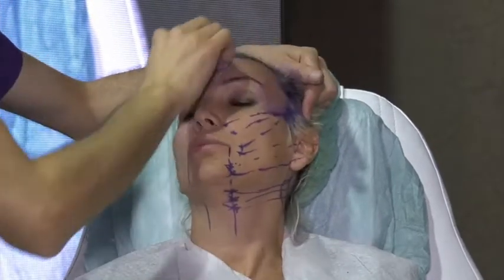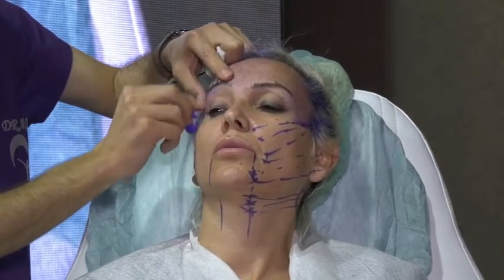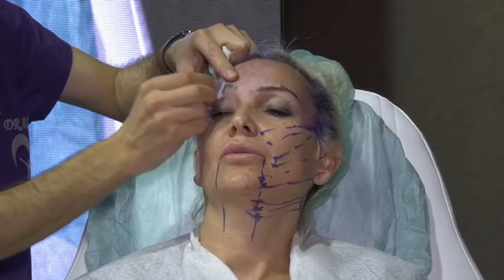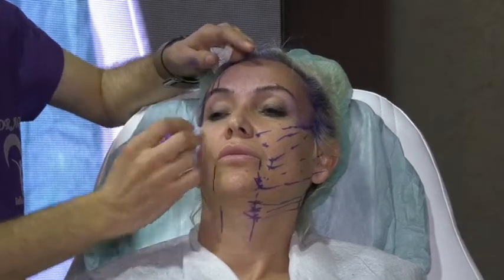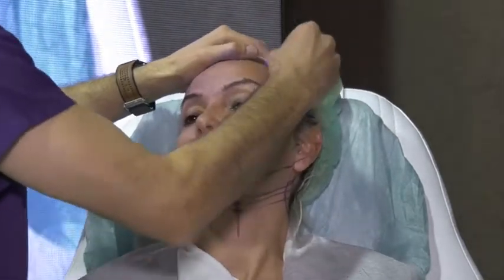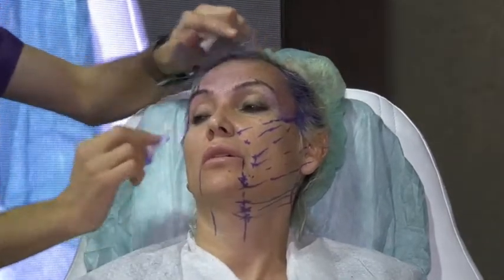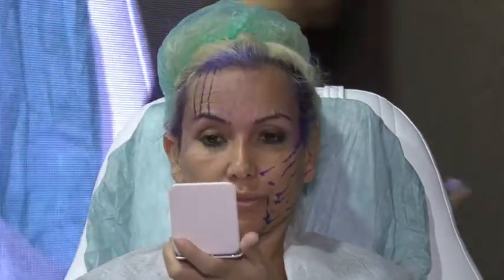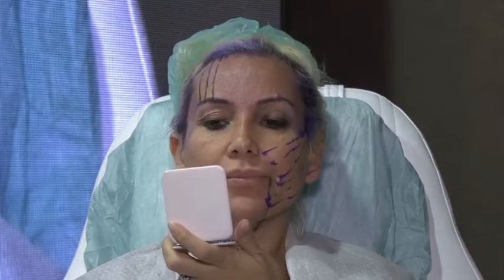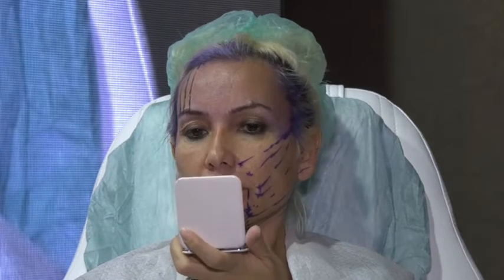Yeah, temple. Press it from up to down and pull it. Just like that. Pull it. Thank you. Where's my glass? Only with alcohol or chlorine you can remove this marker. It's a line now, it's very good. When you work in your clinic, you can make the other lines with the pencil, with the light and marker, it is not a problem. But the entry point, I always make it with the marker.